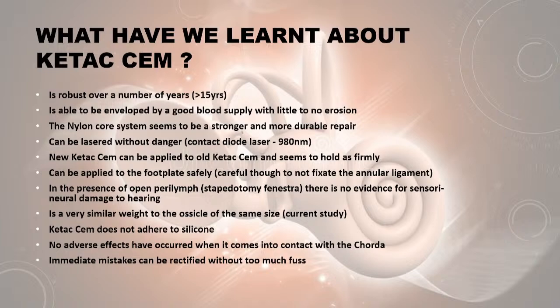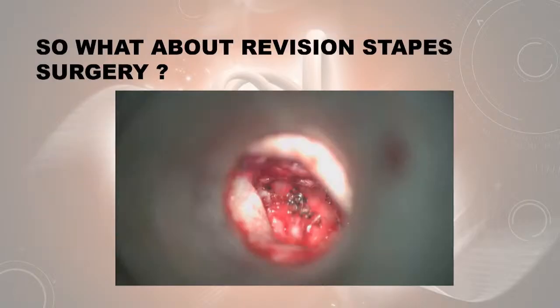It's got a similar weight. We did some studies, very similar weight to the ossicles. It doesn't adhere to silicone, so if you are worried about something sticking to the side, you just put a piece of little silicone and it'll keep it away from attaching. So we've just talked about this. This is the same concept.